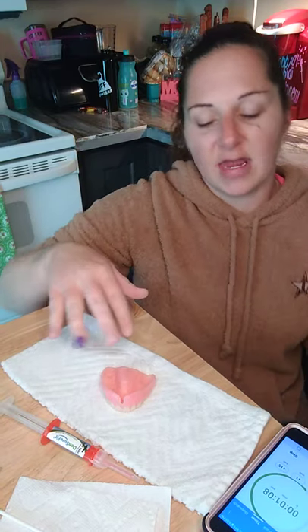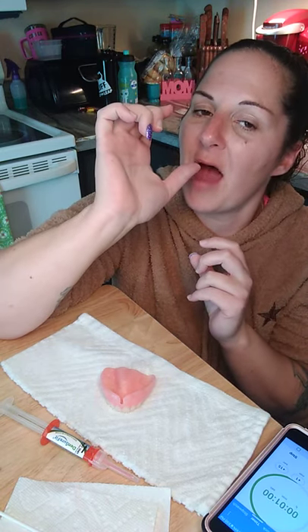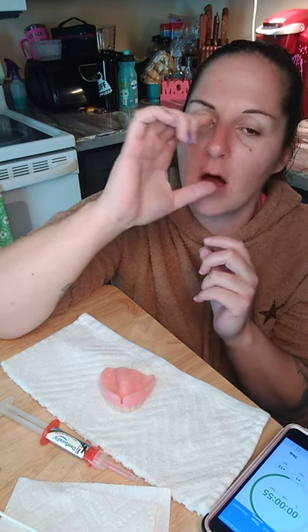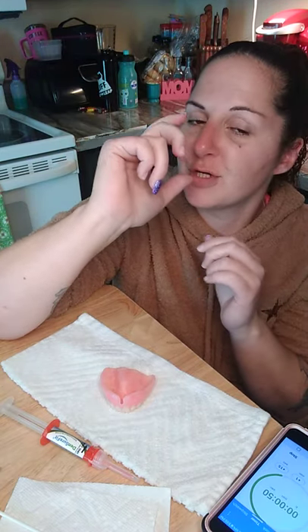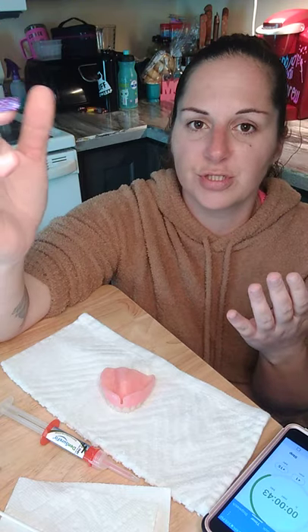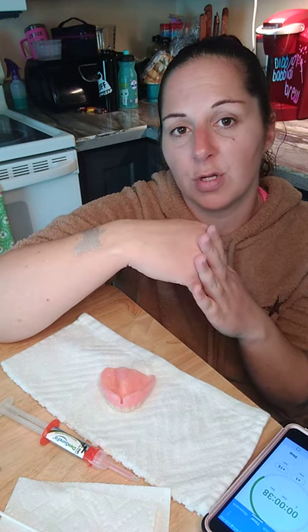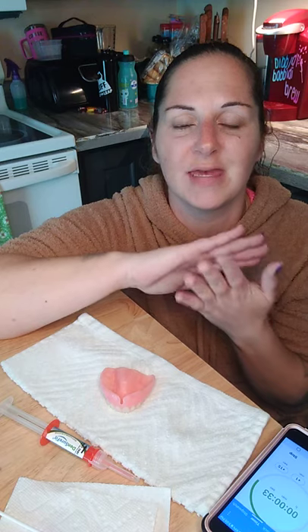Then once you're done with that and you're ready to pop it in your mouth, you have to make sure your suction is good. So you want to put it in your mouth, put your thumb right in the palate, like your little dip-in spot, and you make sure it's in the sucking spot. That's what I like to call it. But it fits in good. So you put your thumb in your mouth, and your pointer right over your nose. Just like a baby would suck on their thumb is exactly what you want to do. If you give a couple of sucks while you're doing that, it'll go into the suction mode. And from there on out, you want to wait 4 minutes before taking it out.